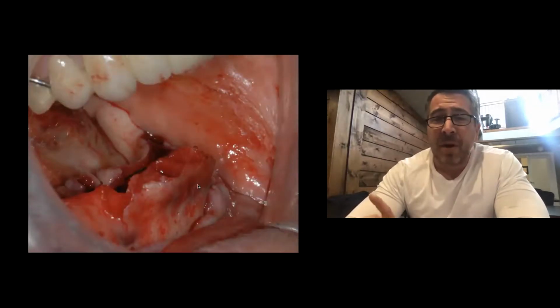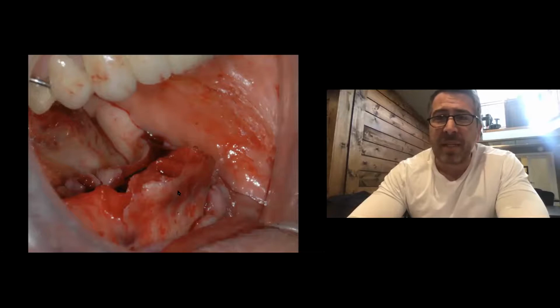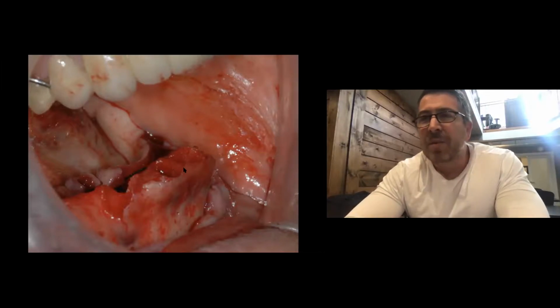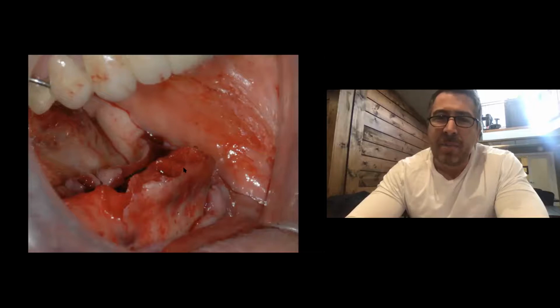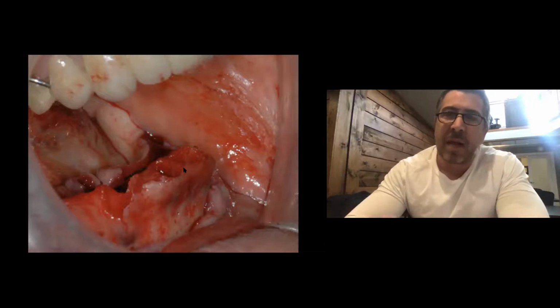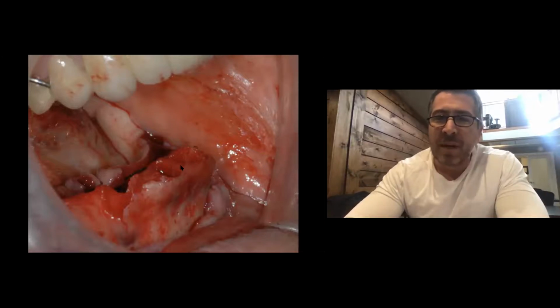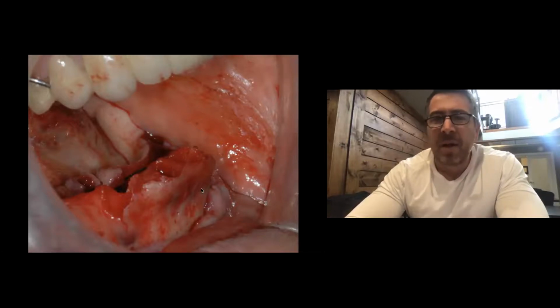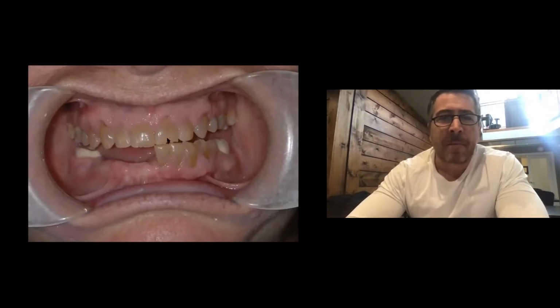The other part of the problem with the mandible is it has a flare to it like the maxilla does. And if you place your implants into the anterior mandible here, starting at this crest, they're going to flare facially. Now, for a single tooth restoration, that's fine because your abutment will correct that and then your crown will slide on top of the abutment. But for an overdenture case, that's not appropriate. So we need to reduce that bone down for interarch clearance and for proper spatial position of the implants.